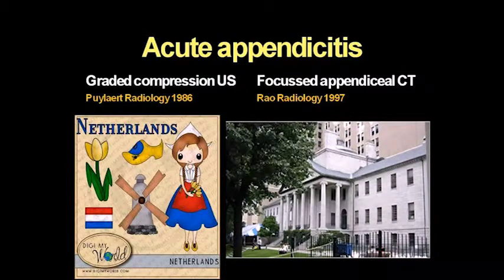15 years later, I found myself as a pediatric radiologist at Mass General Hospital, and I found that this is the institution where the focused appendiceal CT papers originated from. It was a simple concept to give some rectal contrast and see if the contrast enters the appendix.